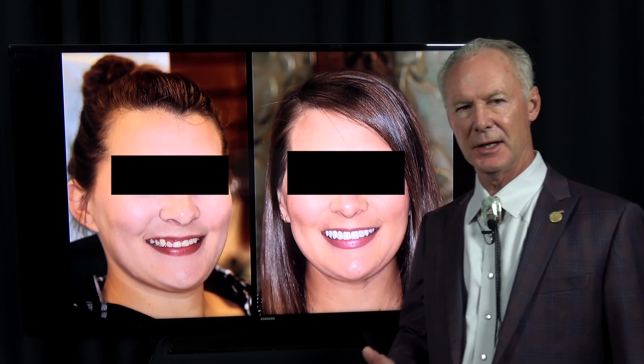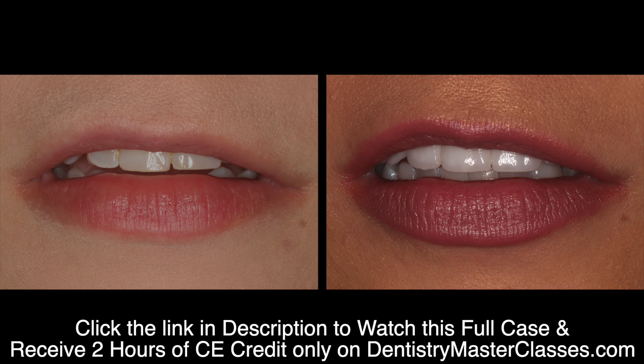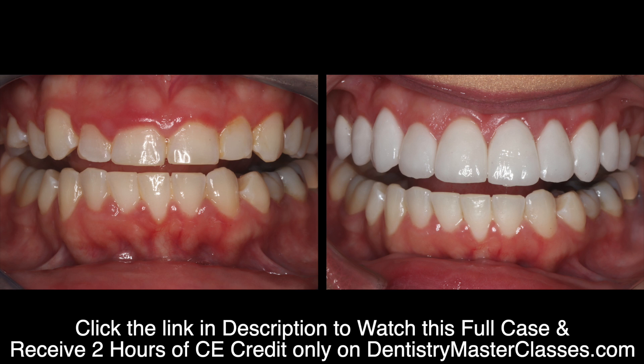Many of you have asked about suturing techniques. I'm going to show you how to suture a periodontal crown lengthened case using 4-0 gut suture interproximally.